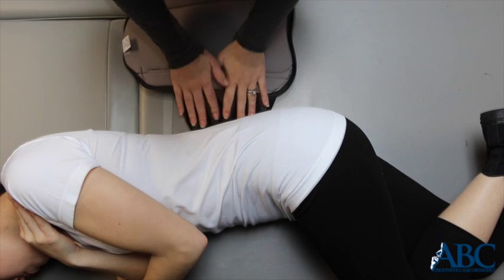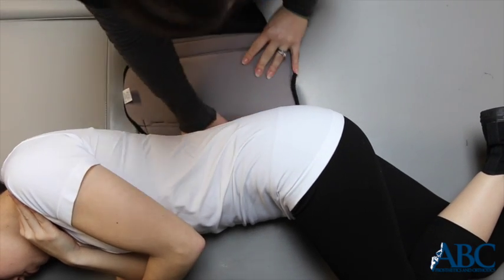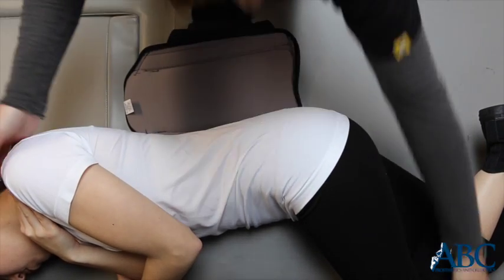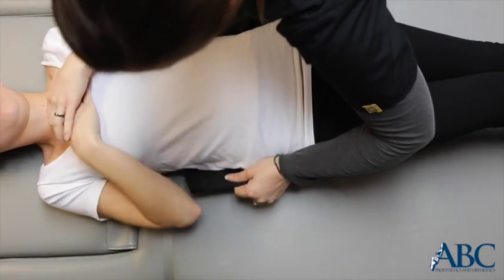Fold the strap under to avoid rubbing the Velcro against the skin. Depress the bed and slide the strap under the patient at the lower waist. The bottom edge of the back panel should be even with the tailbone, and the back panel should be centered on the back when lifted. Roll the patient back to supine.